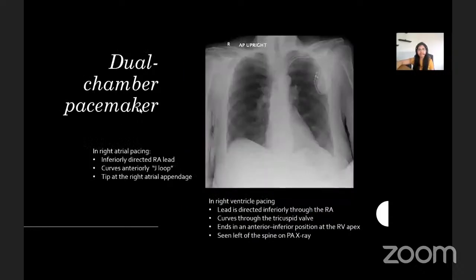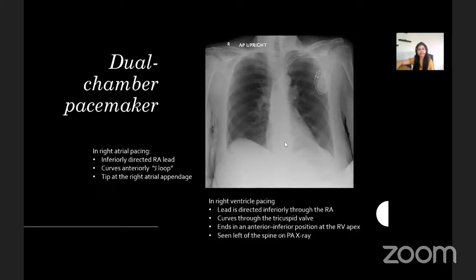Here is a radiograph showing a dual chamber pacemaker. Its generator is seen in the left infraclavicular fossa and it contains two lead wires that allow pacing of the right atrium and right ventricle simultaneously in order to coordinate their contractions. The right atrial lead is directed inferiorly forming a J loop; the right ventricular lead should be seen to the left of the spine on the PA chest radiograph. Dual chamber pacemakers are used in patients with heart block, sinus node disease, or atrial fibrillation with a slow ventricular response.